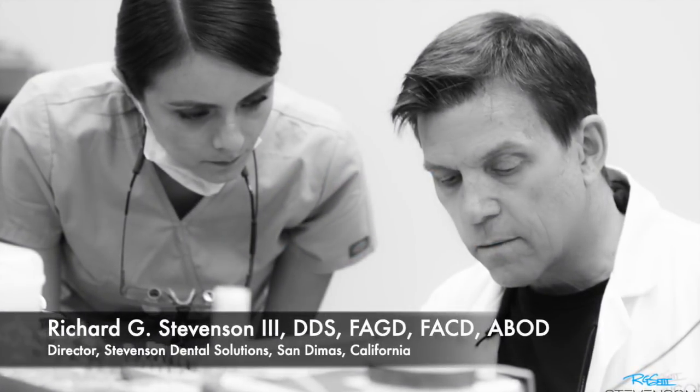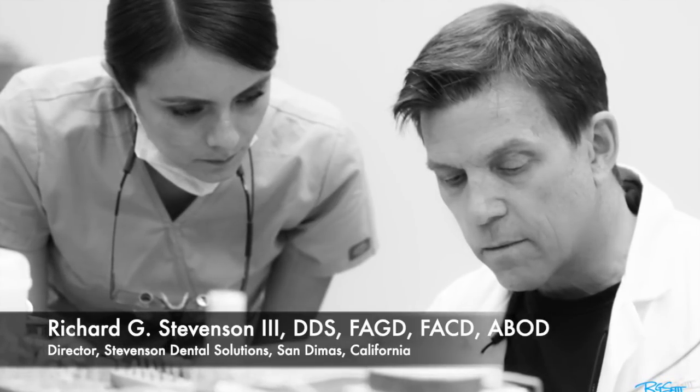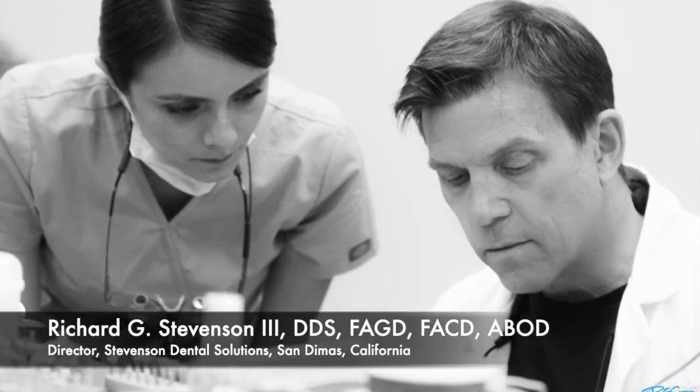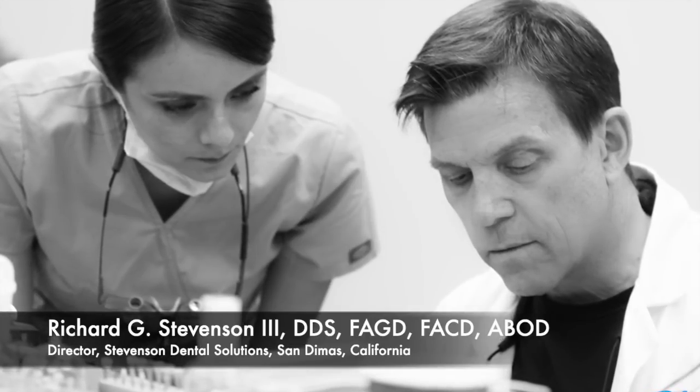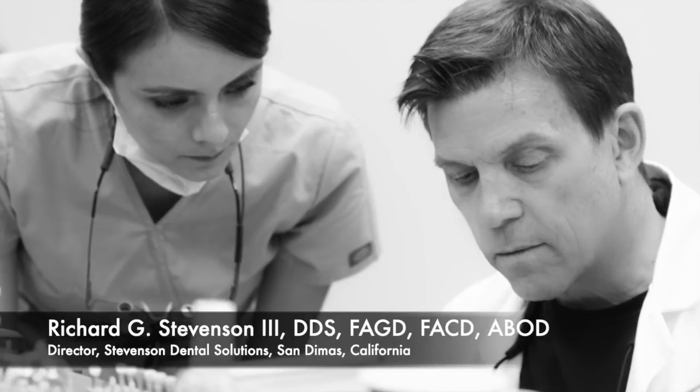Hi, everybody. I'm Dr. Richard Stevenson, and I'm the director of Stevenson Dental Solutions in San Dimas, California. Today we have the first part of a four-part series on ceramic inlay and onlay.